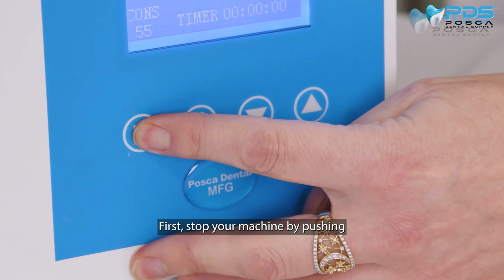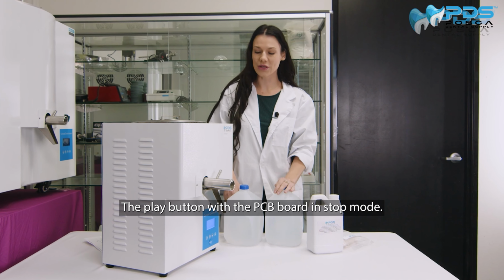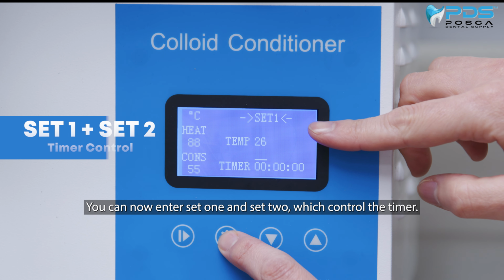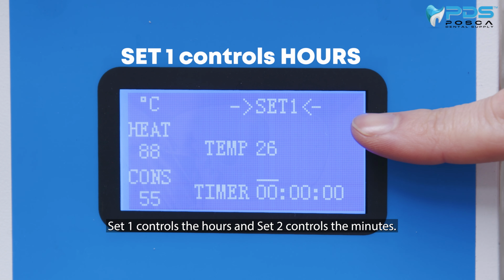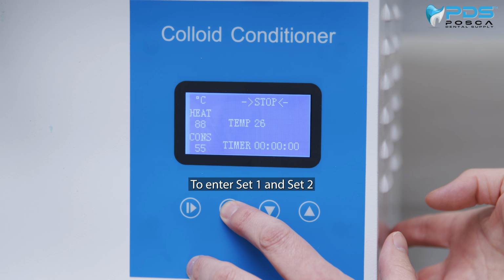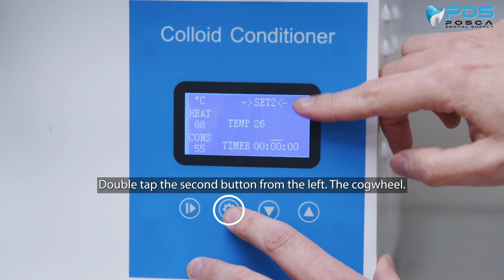First, stop your machine by pushing the far left button on your PCB board, the play button. With the PCB board in stop mode, you can now enter Set 1 and Set 2, which control the timer. Set 1 controls the hours, and Set 2 controls the minutes. To enter Set 1 and Set 2, double-tap the second button from the left, the cogwheel.